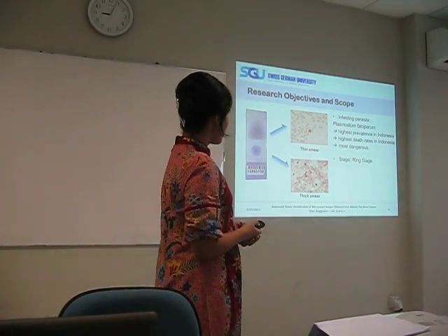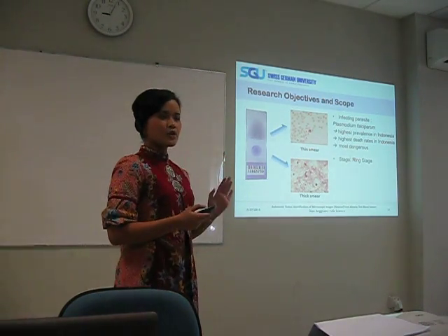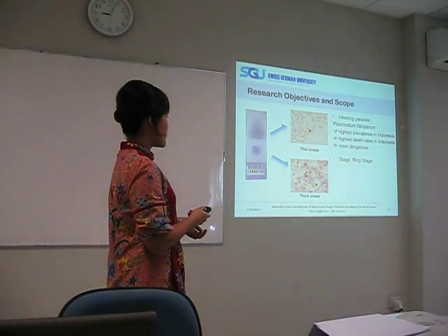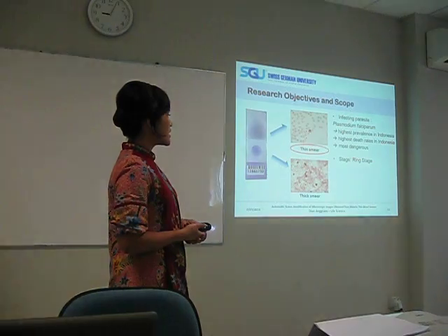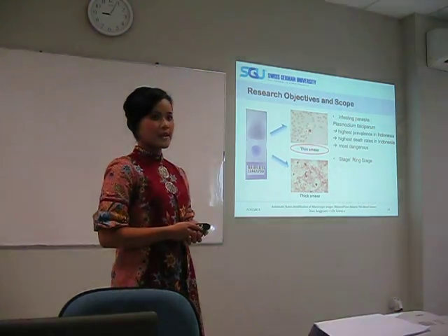There are two kinds of blood smear used for diagnostic purposes: the thick smear and the thin smear. For the time being, we only focus on the thin smear of Plasmodium falciparum in ring stage.